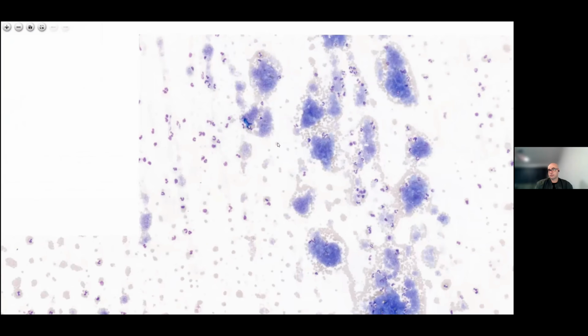It might not be enough to form a physical detectable clot in the sample or detectable sticky fibrin strands. The way you look for a clot in an EDTA sample is with wooden applicator sticks, 1 or 2 or 3 of them. Stick them in the sample, swirl, go fishing about, pull them out, and have a look. You might pull out a big nasty clot or a couple of little clots, or maybe the blood's just extra sticky and you get stringy filaments sticking to the wooden sticks. They're called fibrin strands, and that means a clot has started to develop.